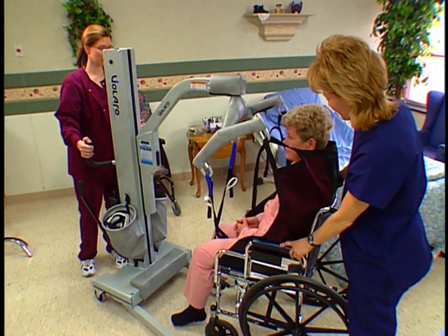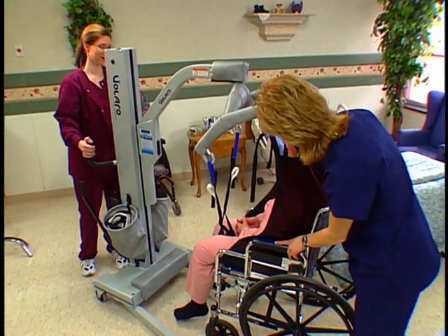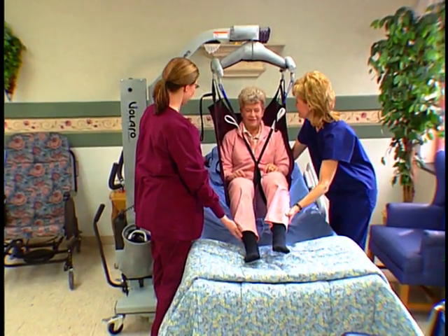Raise the person high enough to clear the bed. Move the resident to the desired location and center the person over the bed.